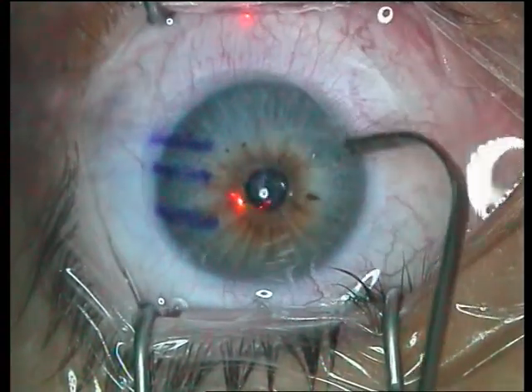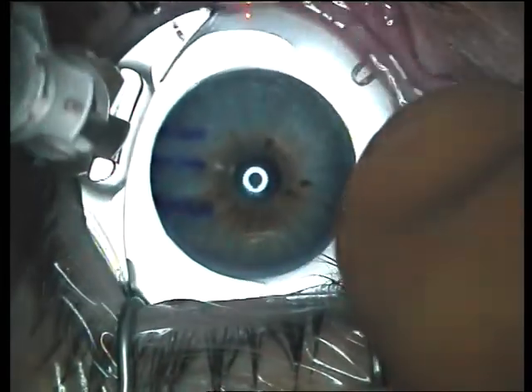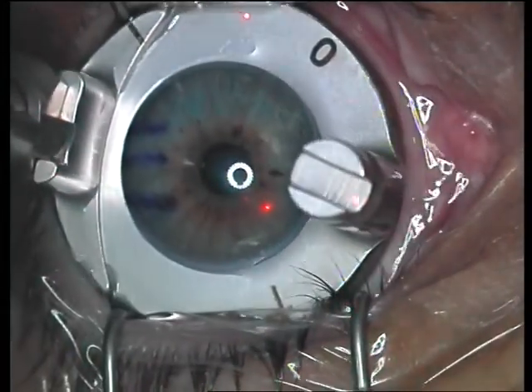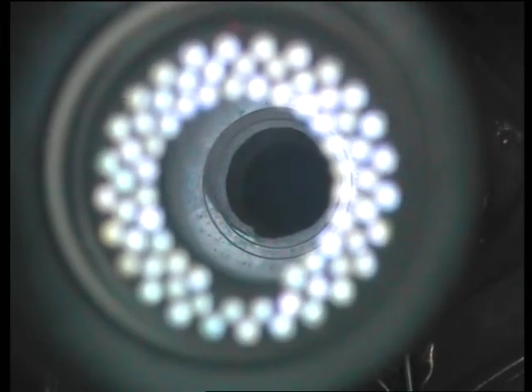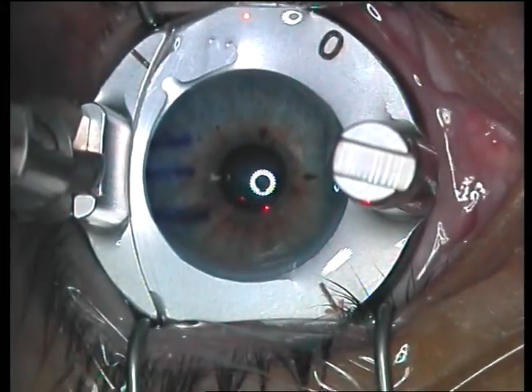In this case, we see the cornea has already been marked. The suction ring is placed on and the suction is started. The applanation is carried out. Here we see that the applanation perhaps is right towards the edge of what is normal, so I recheck it and confirm whether all is well. The cornea is wet with saline.